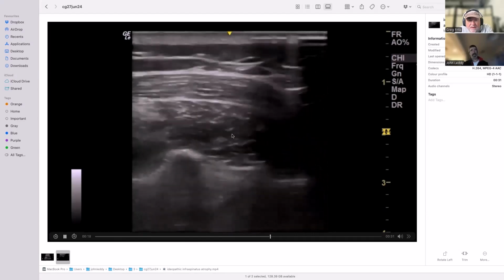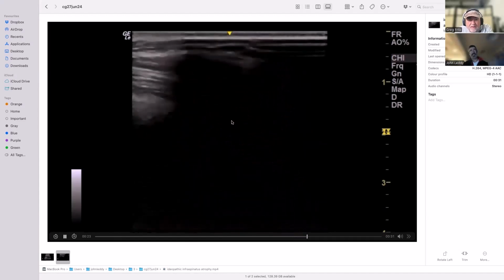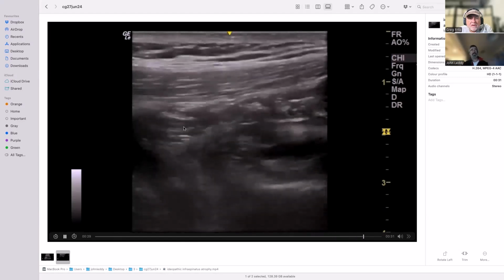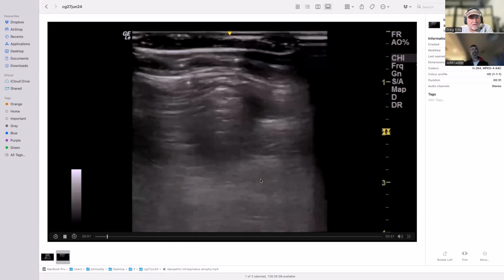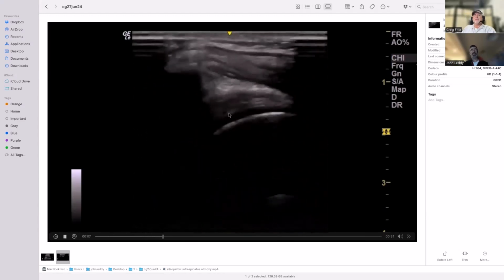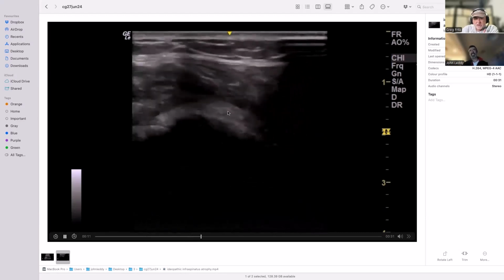And if you compare that to healthy looking teres minor. Yes. And so this, along with looking at the inferior capsule, looking at the muscles is part of my standard routine on every shoulder now. Just because it's not always that straightforward to do. And so if you do it all the time, then you get quite practiced at just swinging down through the muscles, and it takes a second.